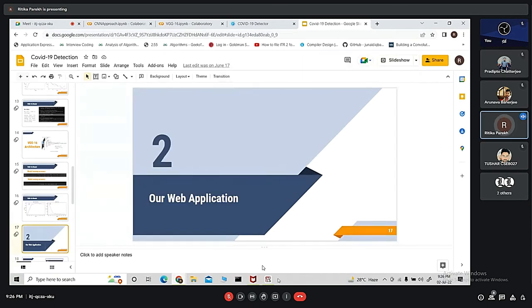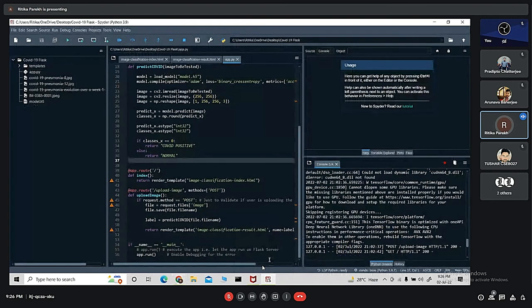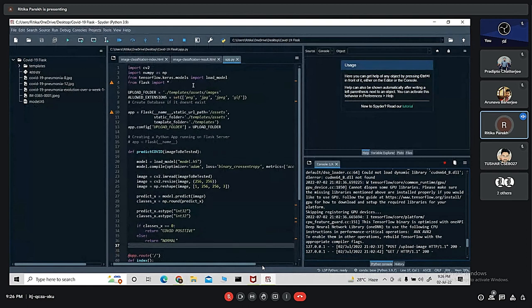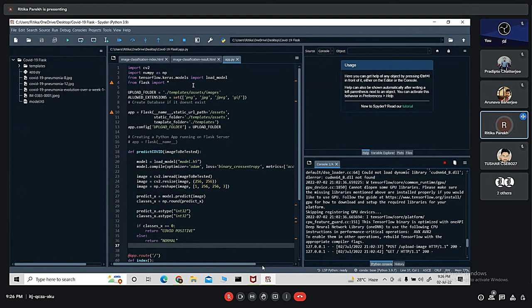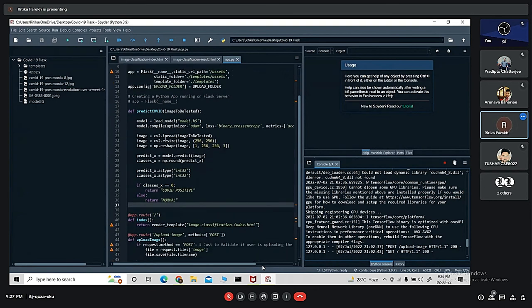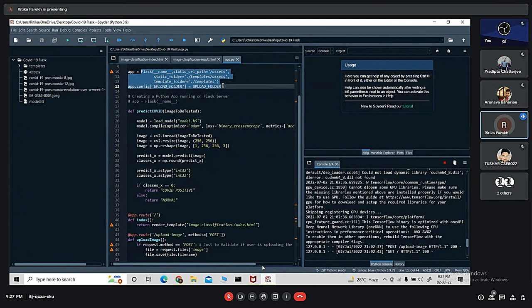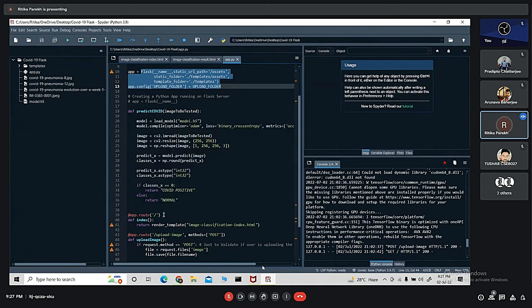I'll jump into the code first and then show you the Flask application. This is our main code. We have used several libraries like cv2, which is open source computer vision library used for image processing, NumPy for numerical operations, Keras for working on neural networks, and Flask which is a web application Python framework. Here we are initializing an instance of the Flask object. app.route maps the URL to a specific function that will handle the logic for that particular URL.